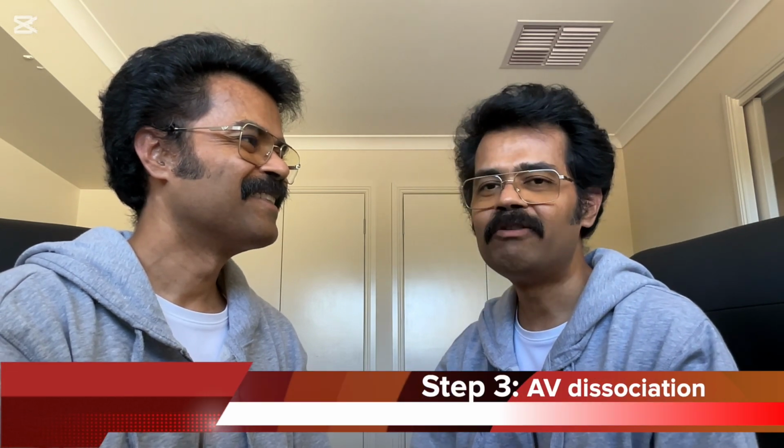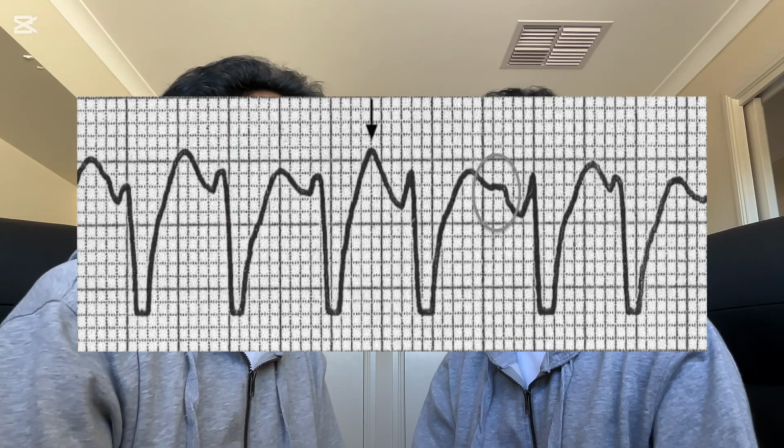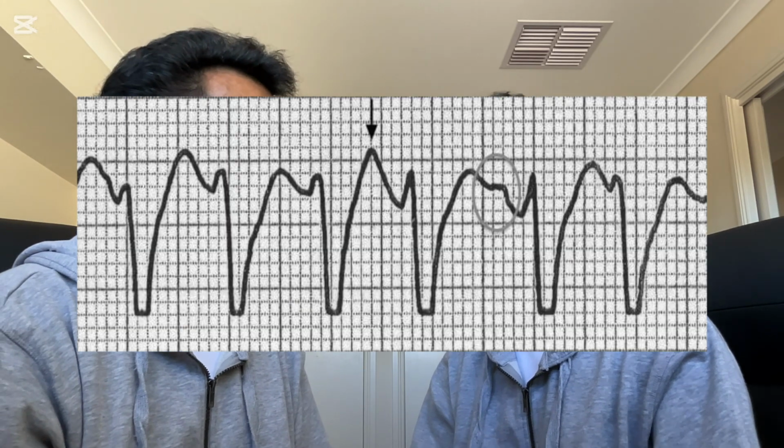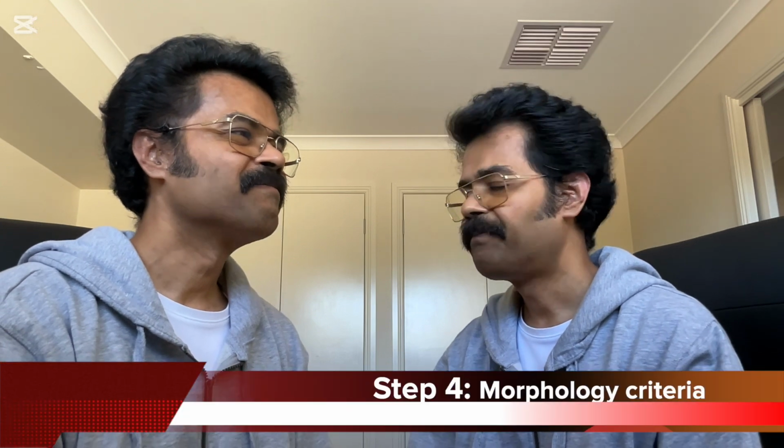If the Brugada sign is absent, then we go for step 3, which is atrioventricular dissociation. The atrioventricular dissociation is relatively simple to identify. If you find a fusion beat or capture beat, that indicates that there is atrioventricular dissociation. There is a 98% specificity for VT. If the step 3 criteria is not fulfilled, then you go for step 4, which is the morphological criteria.